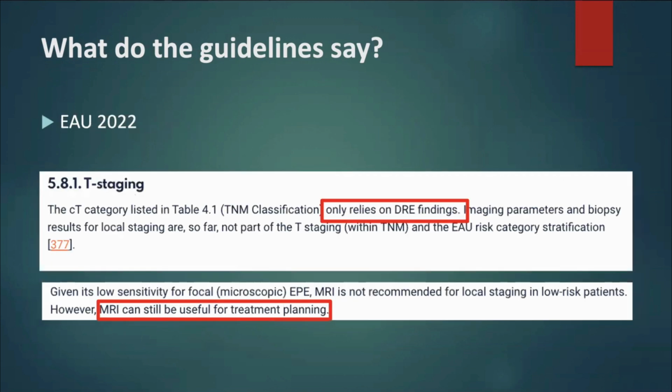This is lifted from the EU guidelines, and it's pretty similar. Again, clinical T staging should rely on DRE findings. However, MRI can still be useful for treatment planning. And they reference the low sensitivity of MRI for focal microscopic EPE, and I'll talk a lot about that later.